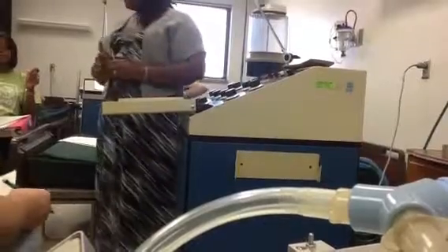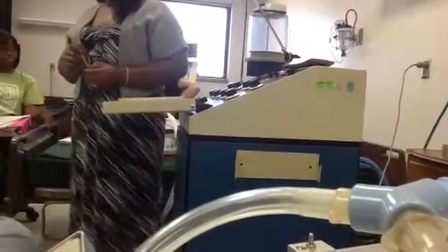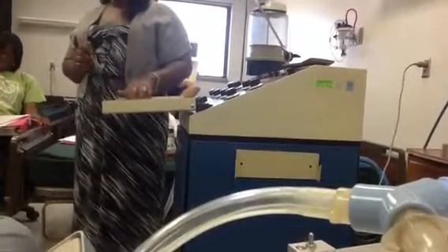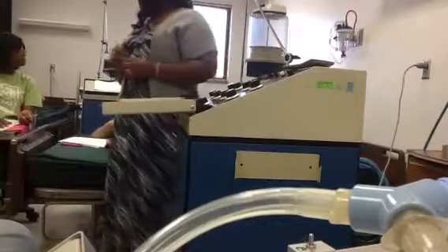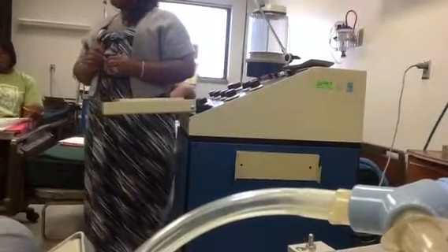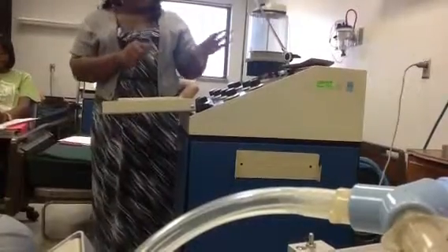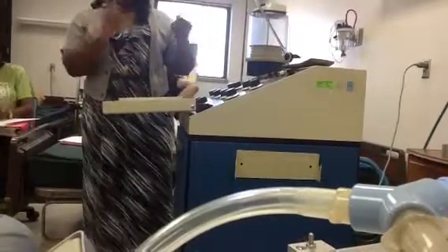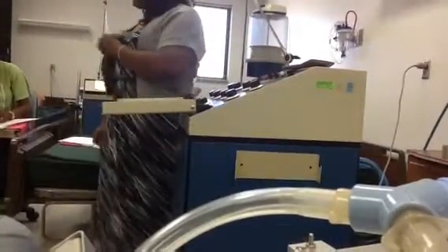Blame the machine. So on our checkoff, are you guys gonna give us a blank sheet like this, and we'll have to sit there and calculate? You'll have a charting sheet. You'll have 30 minutes for your checkoffs. So it'll basically be 30 minutes filling out the sheet. It should not take you that long. You just start the circuit, vent setup, patient, everything, charting. 30 minutes.